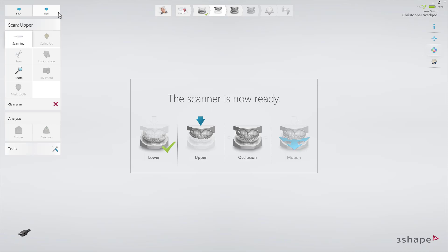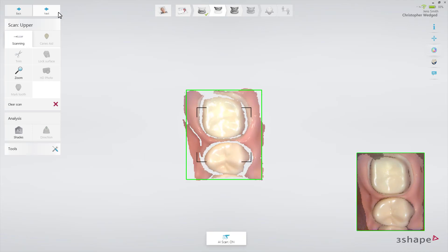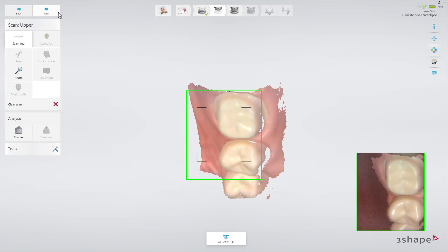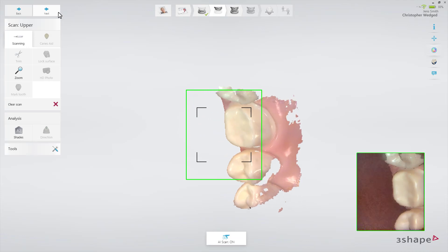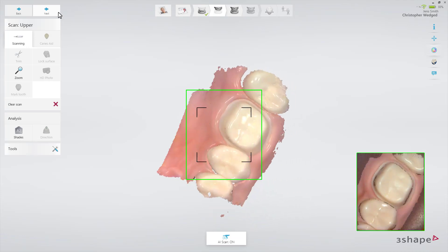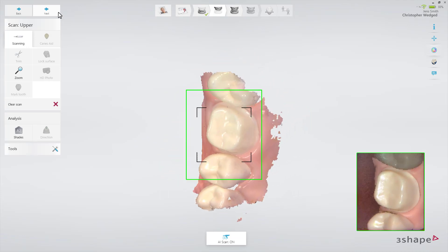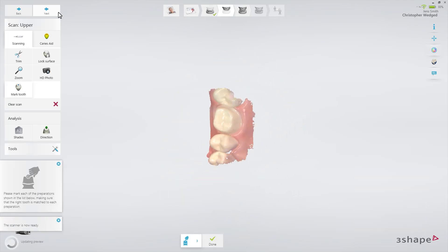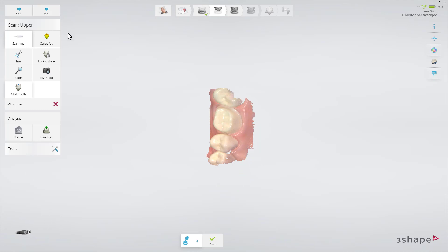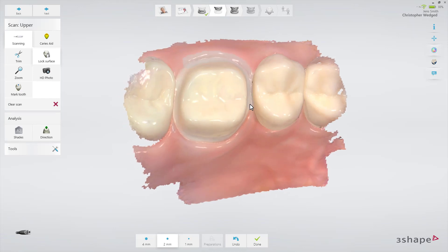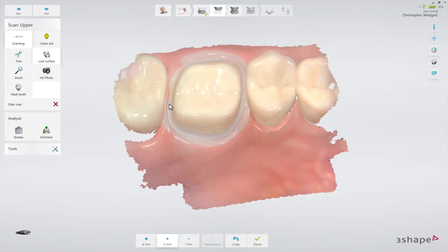There are two ways to scan an arch with the preparation. The first option is to remove the retraction cord, dry the preparation, and immediately scan the preparation with a clear margin before the gingiva collapses. Make sure to get the margin covered well. Then paint the margin using the lock tool. This will freeze the margin in its current retracted state, preventing it from being updated with later data when the gingiva might have collapsed.